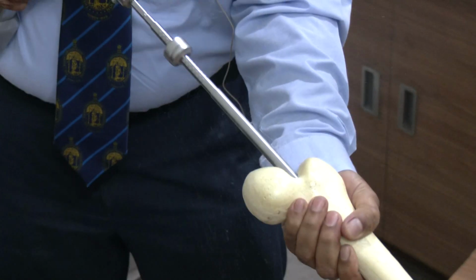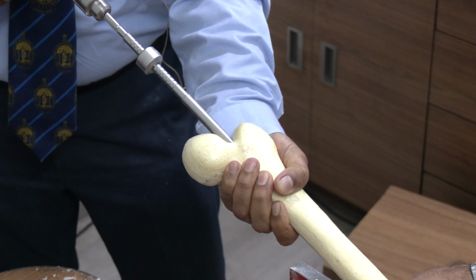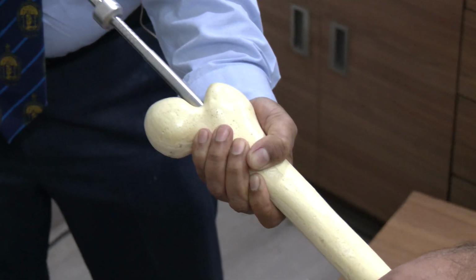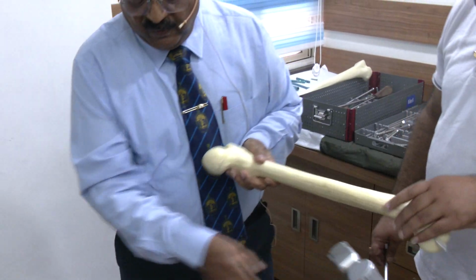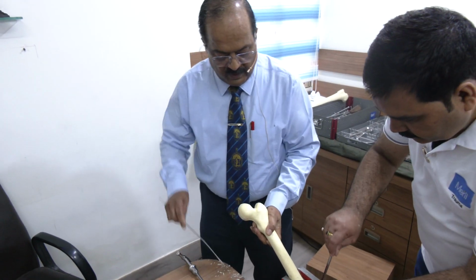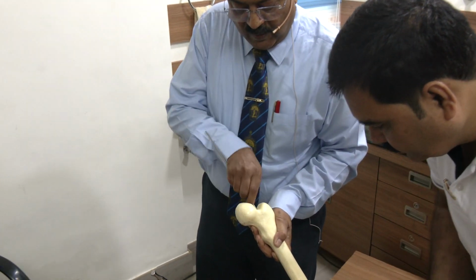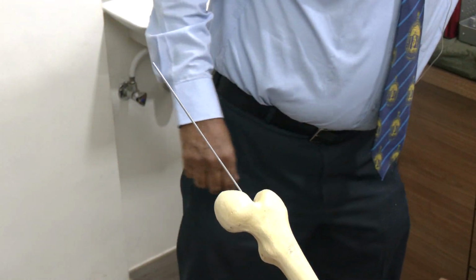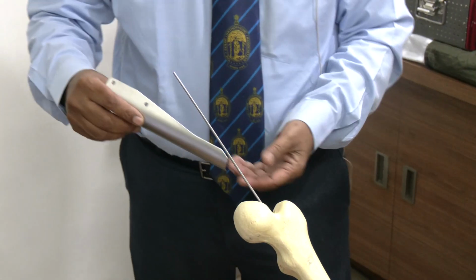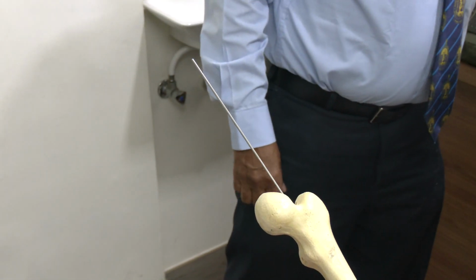So I am preparing the canal first. Okay. So this is now good enough. So now what I am going to do is, now think that we have passed the guide wire. This is the guide pin. Now, as I said earlier, protector sleeve or centering awl. You have to use the protector sleeve to protect the tissue. Centering awl, beach wala, bada wala, 16 millimeter.